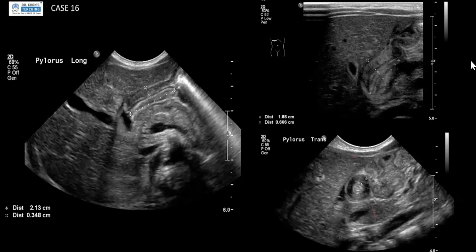The length of the canal about 2 centimeter. It is dilated. In the other view, I see the thickness also here, measuring the total caliber and the length. So all this, thickness of pyloric wall more than 3 millimeter, suggestive of congenital hypertrophic pyloric stenosis.